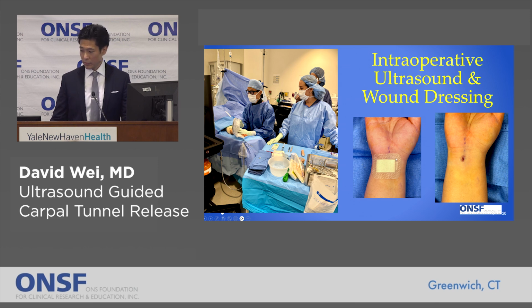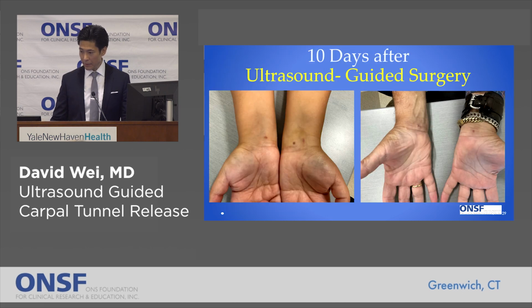You leave with what we say is kind of an occlusive dressing. It's like a Band-Aid, but you could shower right away. People drive home the same day. There's no sedation involved, so it's a very quick procedure. And this is 10 days afterwards. So 10 days afterwards, this is, by the way, a different mark, but this is their incision. So this is a patient who had it done on both sides. It's hardly visible on some of these wrists, so I've been very happy with the results.